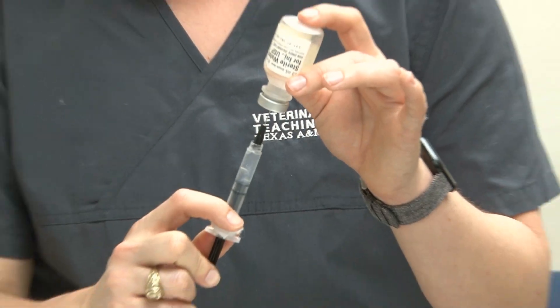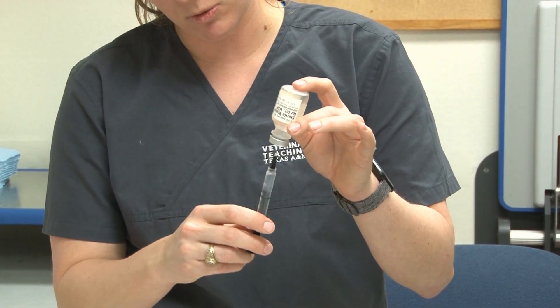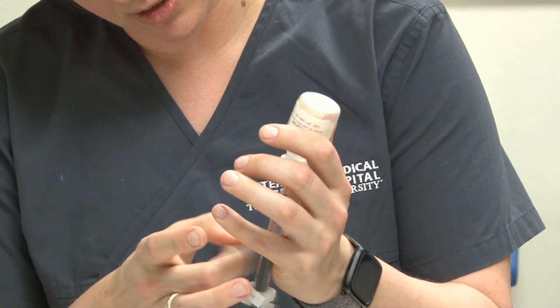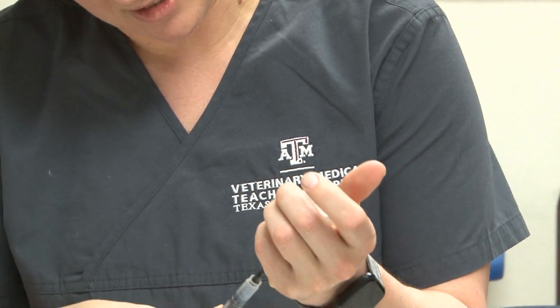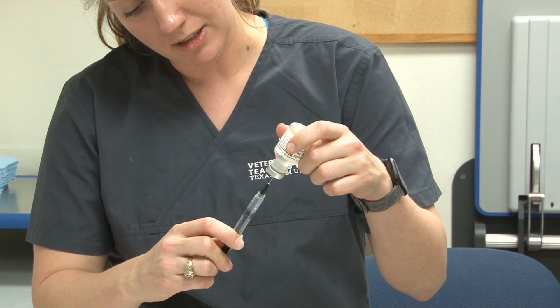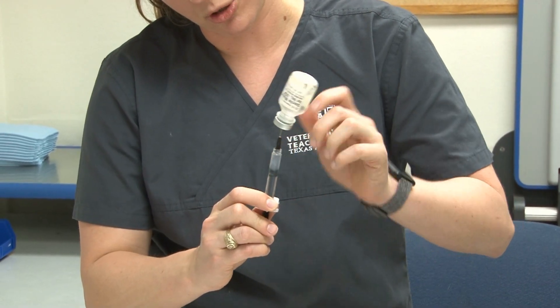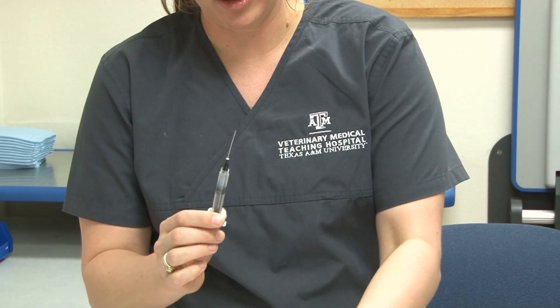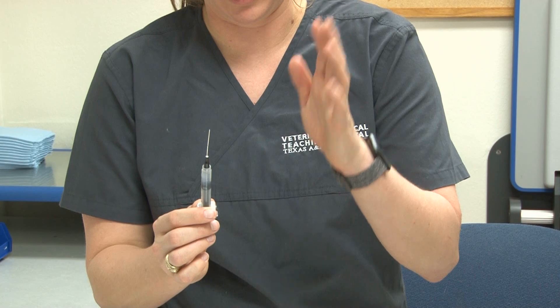We're going to check that we have the right amount — pull this up to one mil. I've got a little air bubble down here, so I'm going to tap it to get the air bubble out. You can sometimes overfill it if you have a bubble, then get the bubble to the top and push it out. Then remove the needle from the vial while keeping it all pointed up.